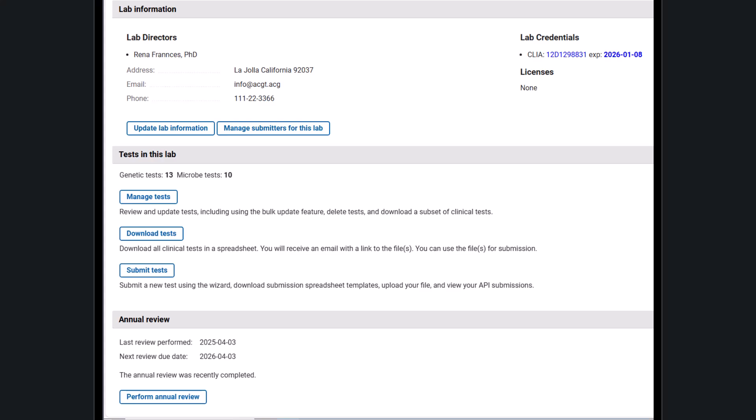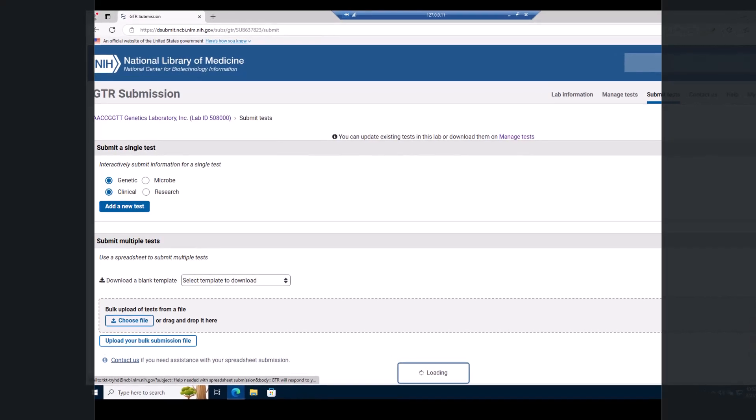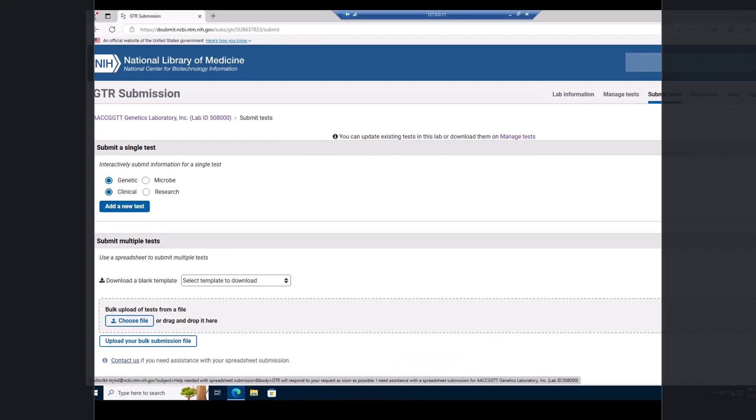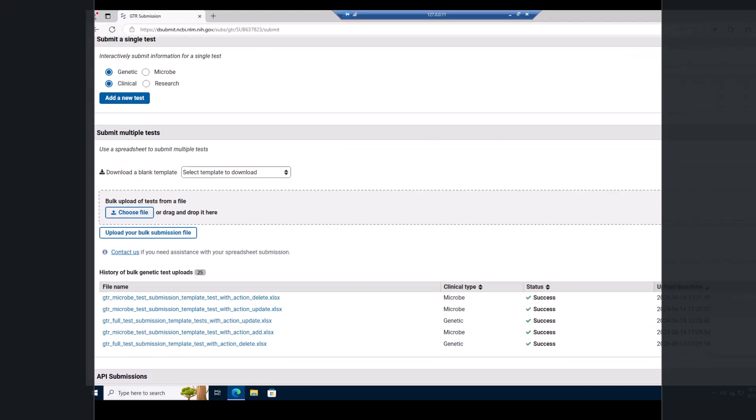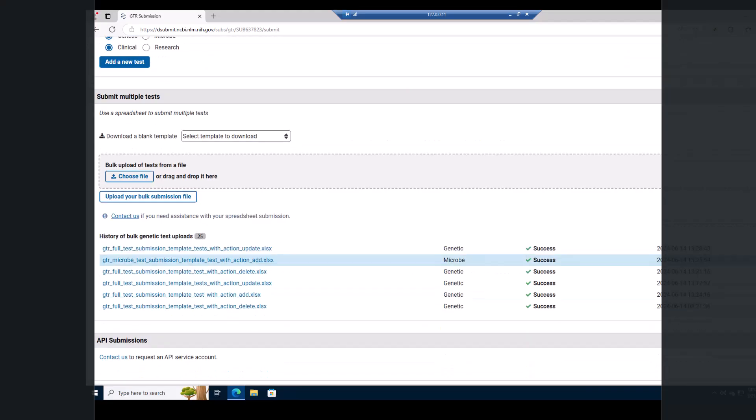On the GTR submission home page, click the download test button to download a spreadsheet with all the tests for your laboratory. You will receive an email with the link to the spreadsheet. Click the submit test button to go to the submissions page. Here, you can submit a new test using the submission wizard or download spreadsheet templates and submit your spreadsheet.